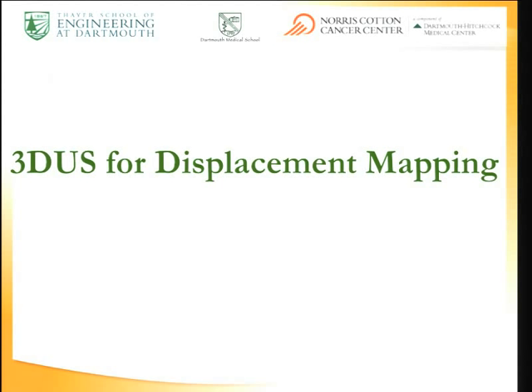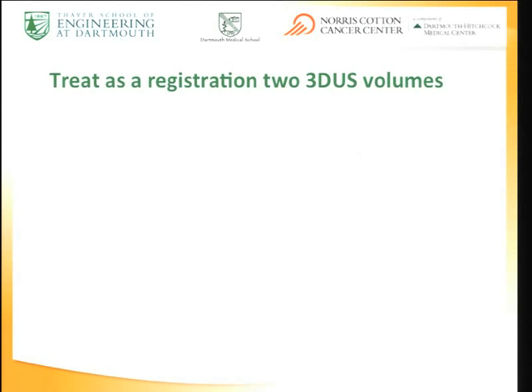So we started out with the idea of using scans taken during the surgery and relating them to one another to try to extract displacement information. From our point of view, we wanted to put that into the modeling process that we had in order to get what we call this full volume estimation and project that back on the MR. So that's where we were going.